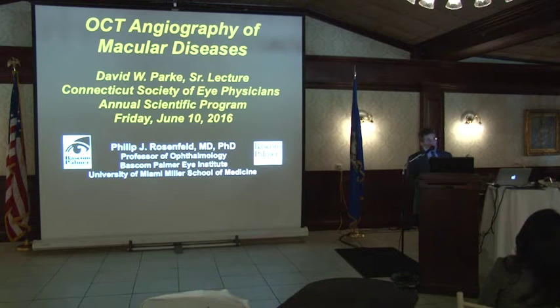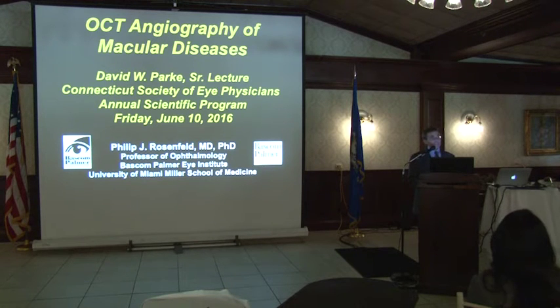And I've had the opportunity since my early years at Mass Eye and Ear, starting in '91, to see this technology evolve first in Boston and then through Zeiss, and now spreading through a number of companies throughout the world. And for the residents in the room, when this technology started, no one thought it had a chance. We didn't think that it could really show us what we needed to see in the back of the eye. But the technology evolved, and in the early 2000s, we had time domain, and then in the mid-2000s, we had spectral domain. And what I'm going to share with you today is swept source OCT.